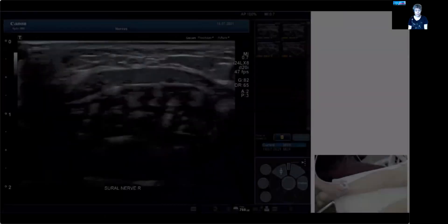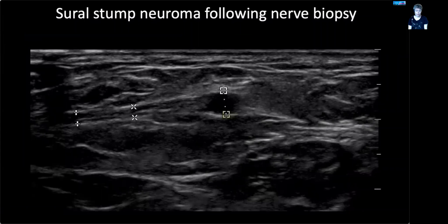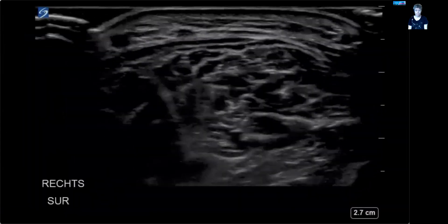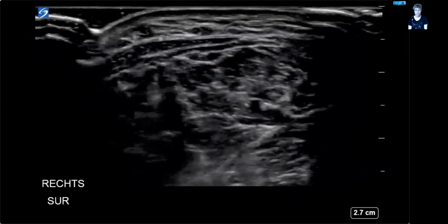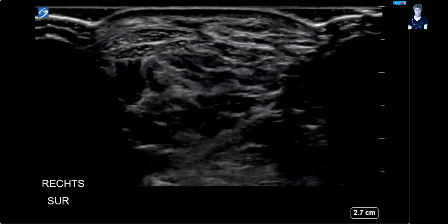This is also a nerve you can and want to measure. You freeze the image, select your measurement tool — in this case the ellipse — cut the nerve in two lengthwise so the two mirror halves, and then fit the tool. You can see that it's almost 1.9 square millimeters. Here's an example — a longitudinal image of a stump neuroma of the sural nerve following a biopsy. You can see the normal sural nerve becoming a bulbous structure and then completely gone — this is after the resection for diagnostic purposes.